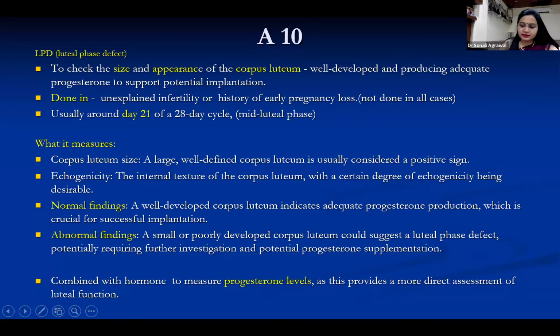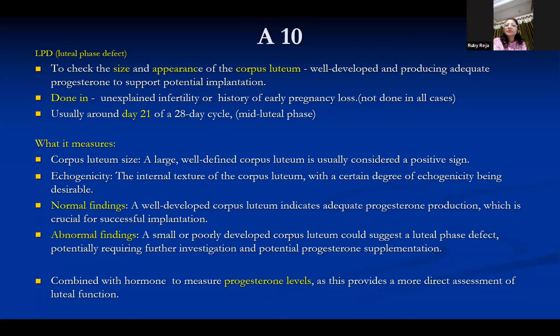Right. By mid-luteal scan, we can assess the corpus luteum and the endometrium function, the RI and PI, and the level of progesterone for better assessment of the endometrium. So what are the chances of implantation, proper implantation, that can be assessed?